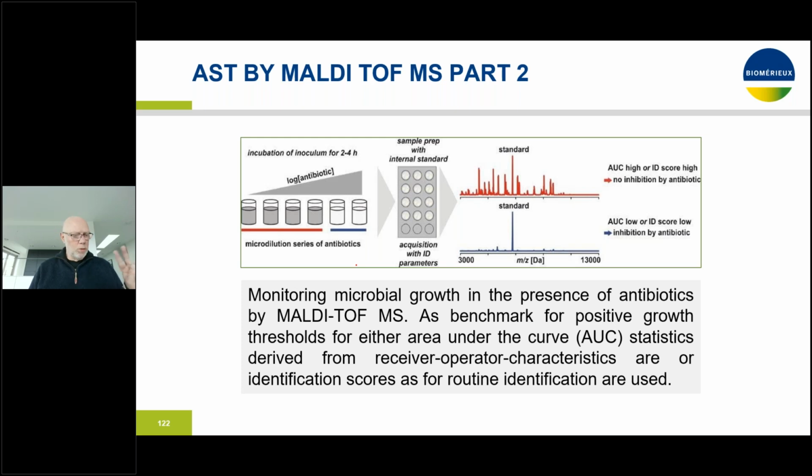And the other 2 problems with mass spec and AST at this stage, and I'm sure somebody will find a solution for that in the years to come, is that currently most of the assays have to be serial. In most of the automated AST instruments, at any time you can plug in another card or another cassette with another organism with hundreds of antimicrobials, and then the measurements will begin immediately. In mass spec, you will have to wait till assay 1 is done, and then you can continue with the next, and that may take some time and effort.